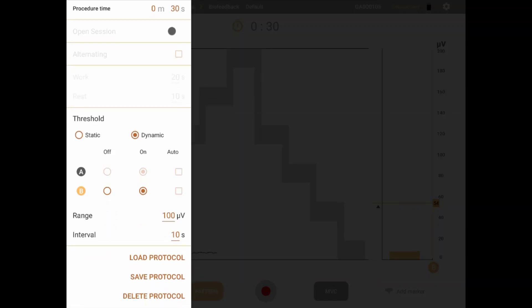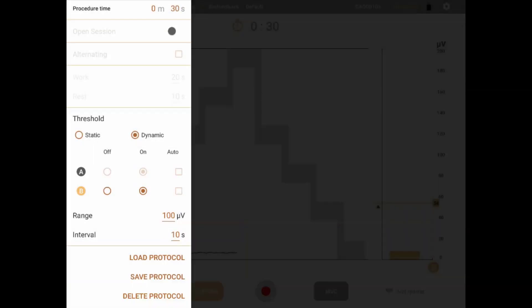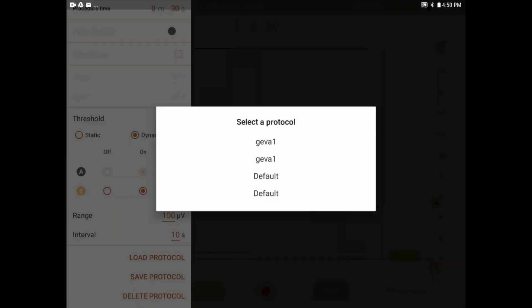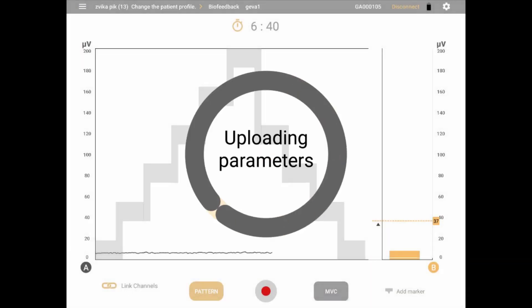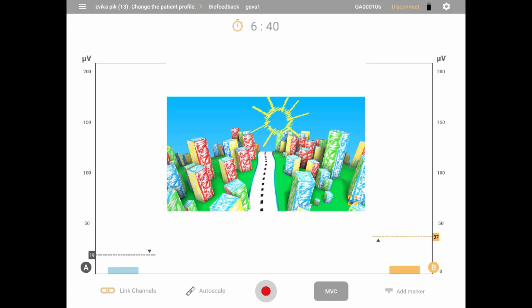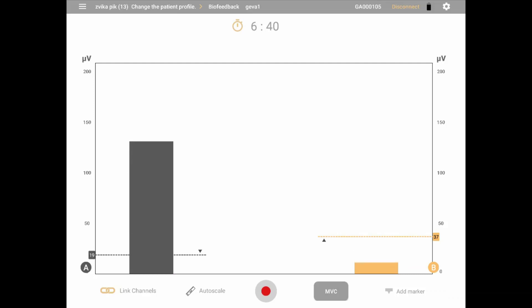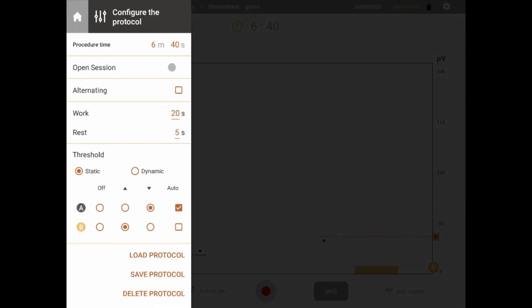Finally, you can save all the adjusted settings as a protocol to be available at any time, or load a previously created protocol from the bottom of the menu. Keep in mind, even if you do not save the protocol, as long as a patient is selected, the same settings will be remembered for that patient and loaded again the next time you start a session with them.